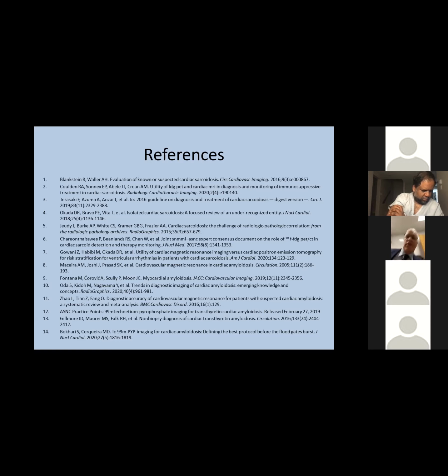Okay, that's good to know. Because otherwise, you can wait a week and you've got someone with complete heart block sitting on the CCU. Why not just put a pacemaker in, because they still need the pacemaker. So that's good to know. As far as I understand, there is a waiting period. So after they have a pacemaker, they can't undergo MR for a certain number of weeks, right?